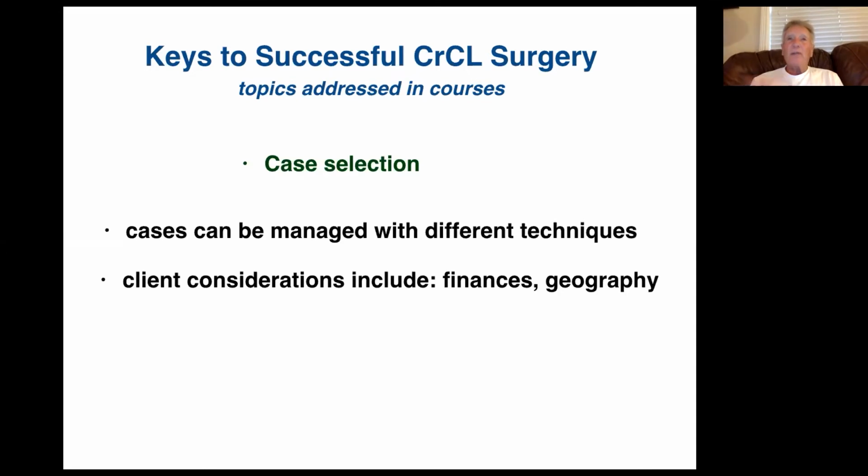They just don't have the financial means to do so. But if you learn the technique and learn the proper planning and execution, postoperative care appropriately, you can help those clients considerably. And it doesn't have to be a mechanic altering technique. Again, if you're just starting out, it can be with the extracapsular techniques and doing them properly. So you can help these clients significantly that don't have the financial means to go to a specialist.